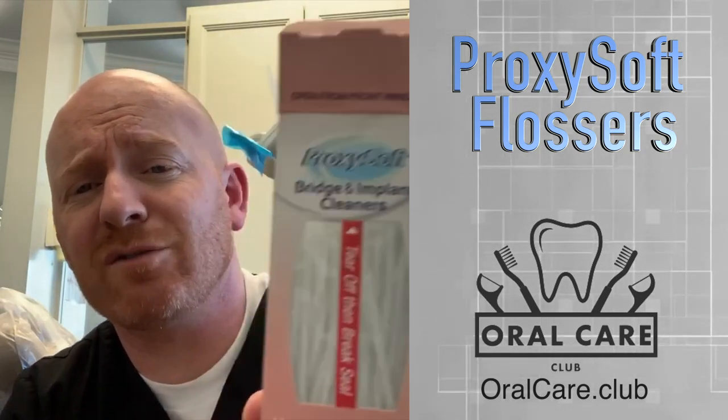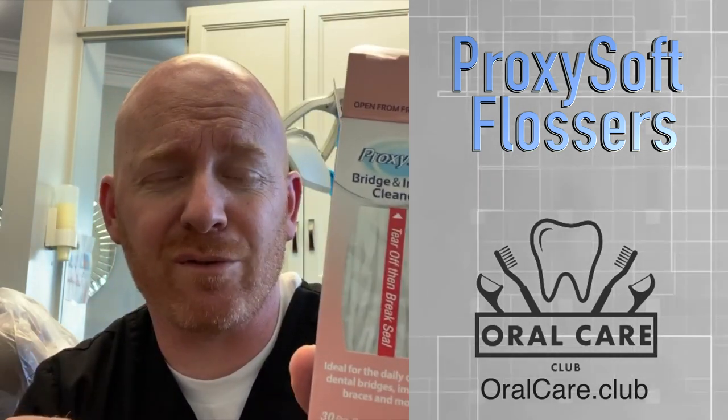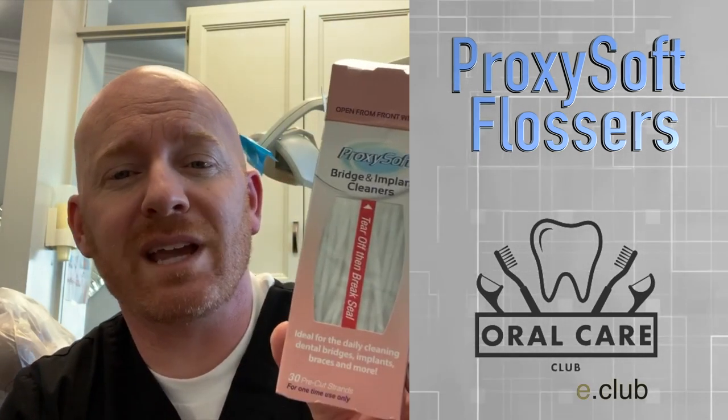So Proxisoft Bridge and Implant Cleaners — you can find this and all other kinds of tools that are helpful for different dental needs at OralCare.Club.